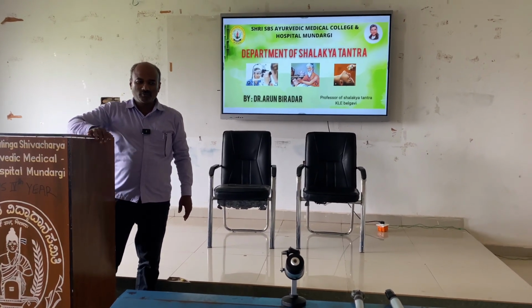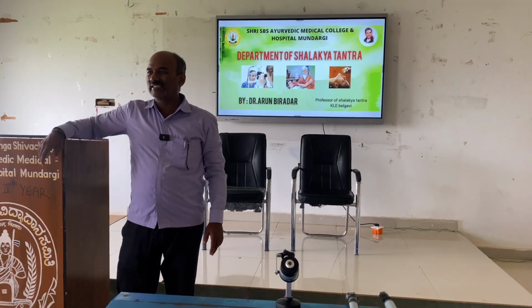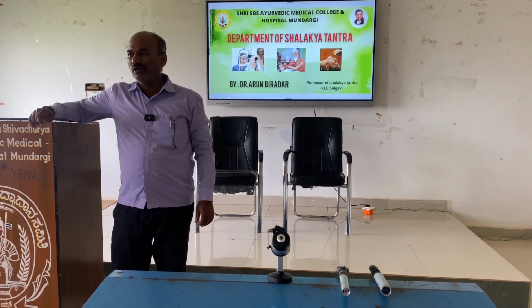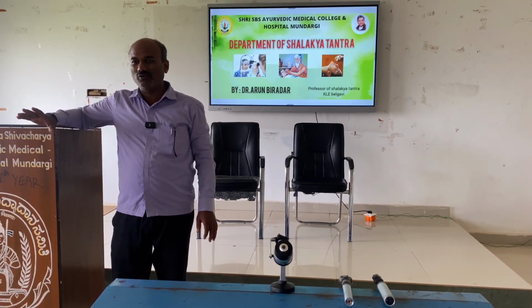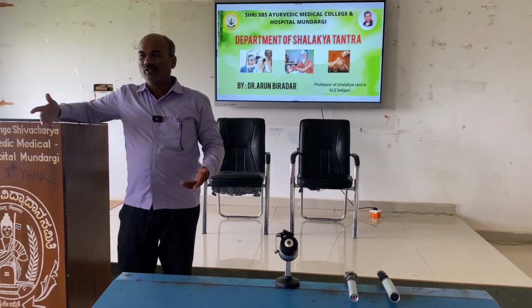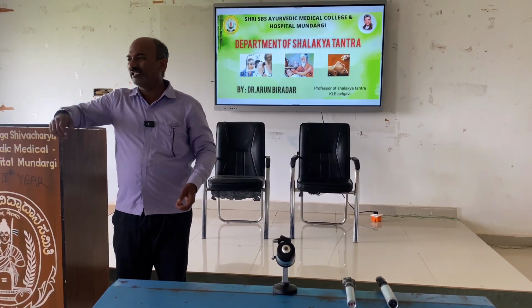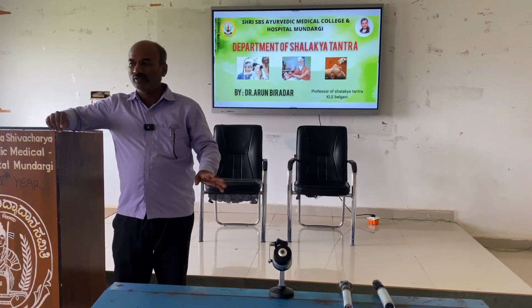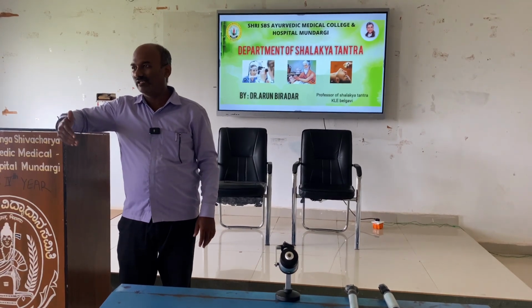Right. So today we will discuss basic examination of the eye with the help of an ophthalmoscope. You have various scopes. Scopes means to see things, to observe things. Not always seeing, like the stethoscope, where you cannot see anything, you just listen, right? So the ophthalmoscope is an instrument with which you examine the eye, right?